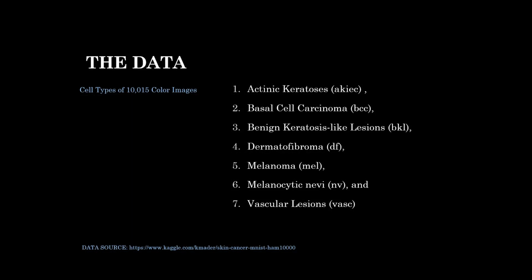The data used for this project was a collection of 10,015 dermoscopic color images sized at 600 by 450 pixels. Dermoscopic imaging produces moderately low noise levels and relatively uniform background illumination. The images had been previously cropped and centered. That's not to be confused with pixel centering.